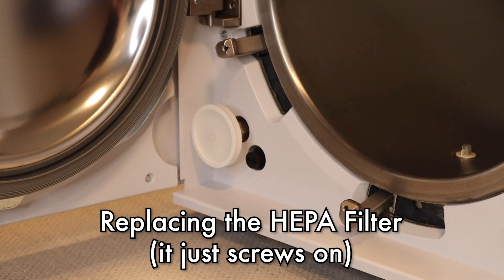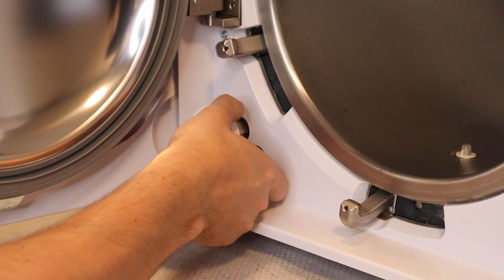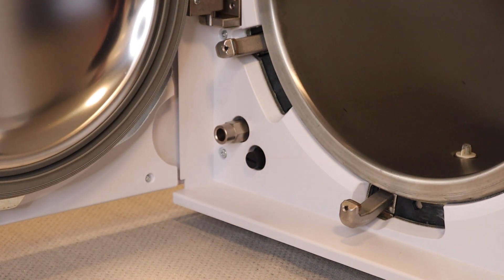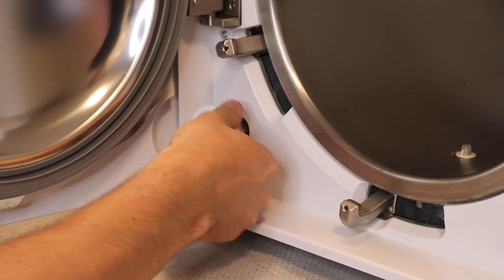To begin with the HEPA filter, you're going to unscrew counterclockwise to remove the old HEPA filter. Then you're going to grab your new HEPA filter, put it inside of the gray hole, and then spin clockwise to tighten down.